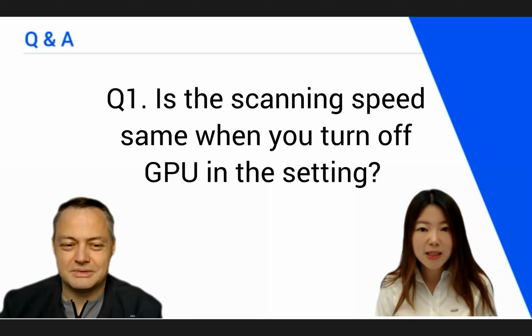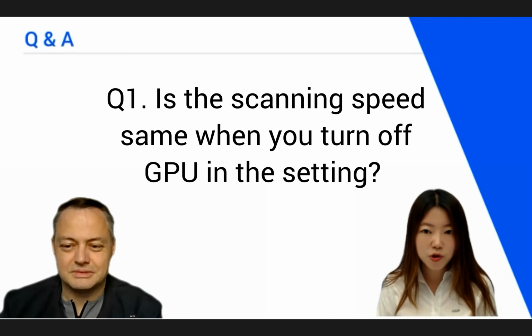So I've got 3 questions today. Question number 1. Is the scanning speed the same when you turn off GPU in the setting?